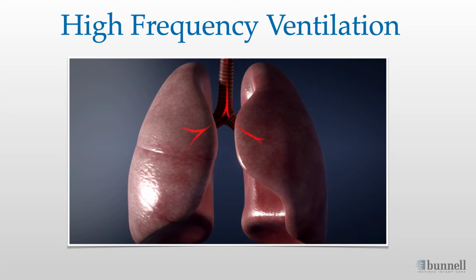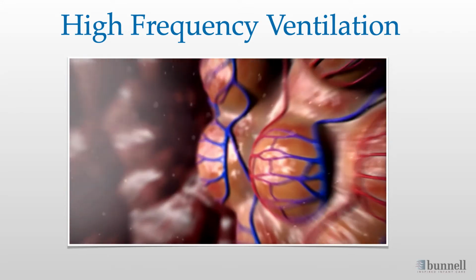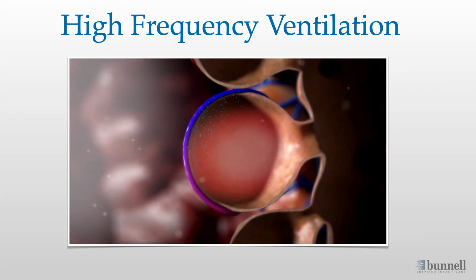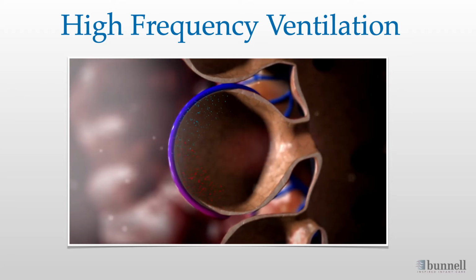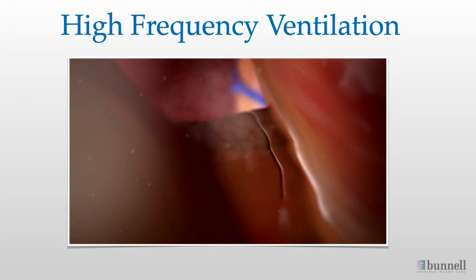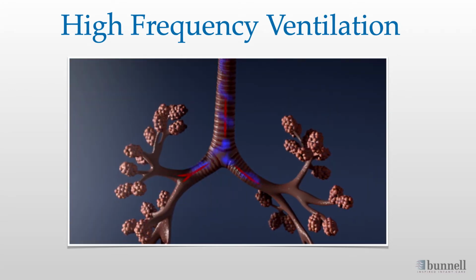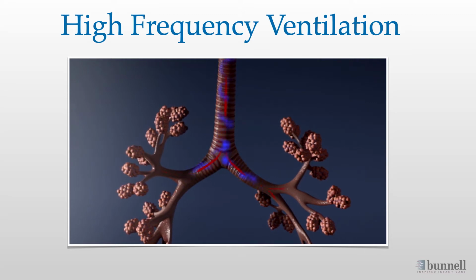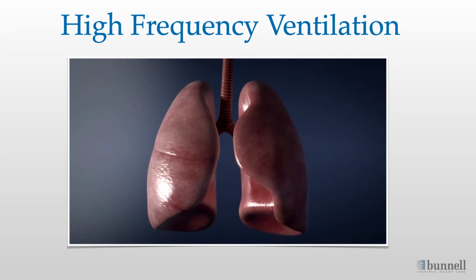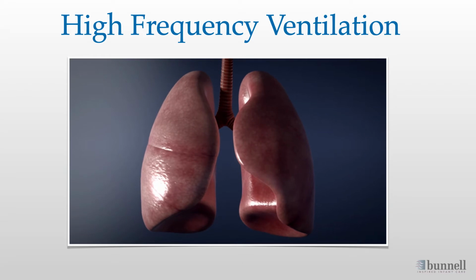The jet offers important clinical advantages over other forms of ventilation. Small tidal volumes combined with extremely short inspiratory times create the lowest possible peak and mean alveolar pressures. Gentle breaths from the jet allow air leaks to heal. Passive exhalation is possible by exhaled gas following the path of least resistance, swirling out and around the incoming gas. Less mean airway pressure is required to maintain airway inflation during exhalation. Adjusting settings on the jet allows for a very long expiratory time, which is beneficial for avoiding gas trapping.